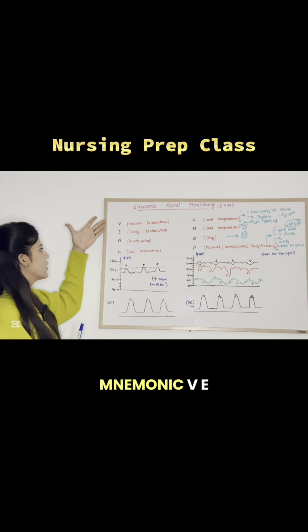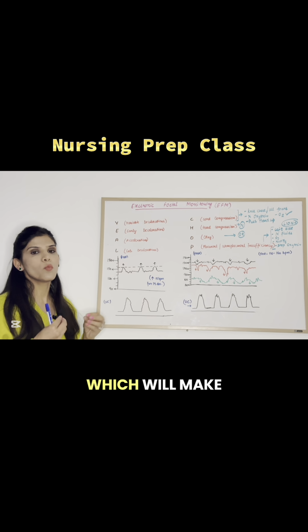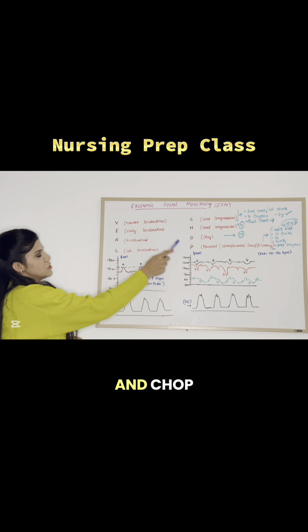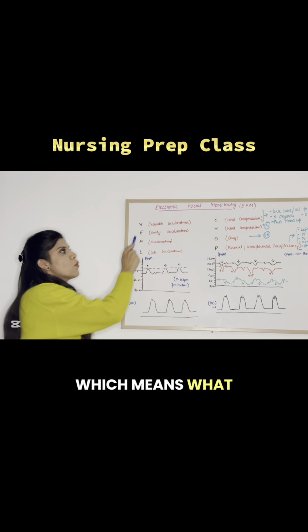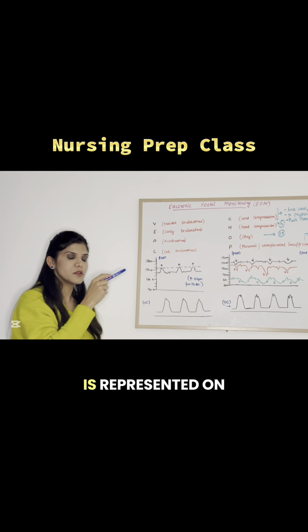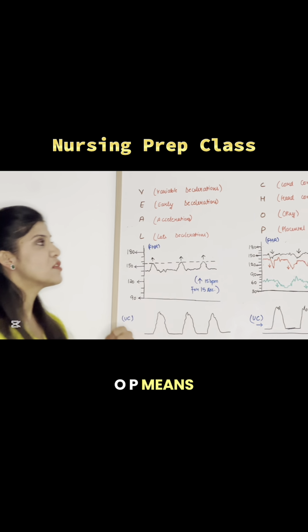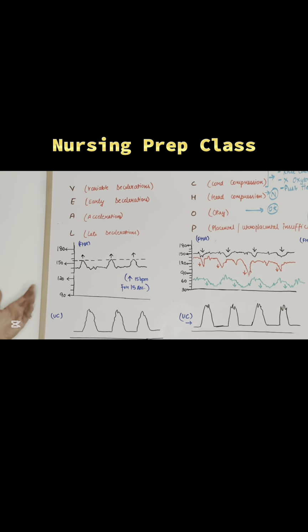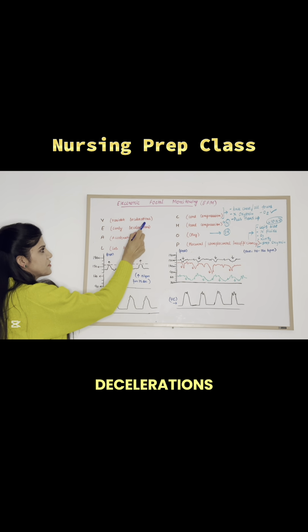So we have this mnemonic, VEAL CHOP, veal, chop, which will make things easy for us. We need to just memorize veal and chop. VEAL means what condition is represented on this graph, and CHOP means what is the reason behind that graphical representation. For example, V means variable decelerations.